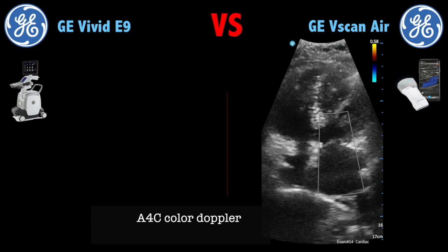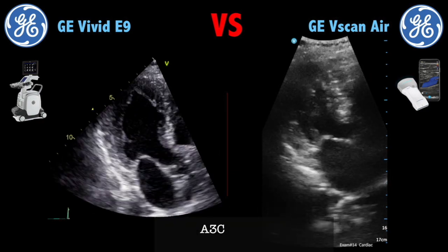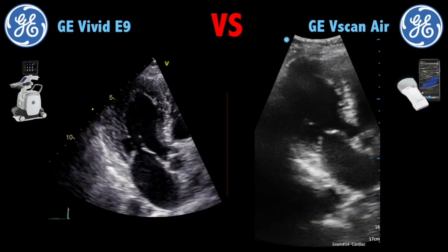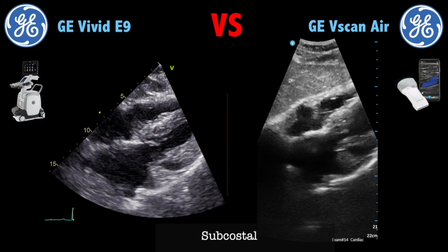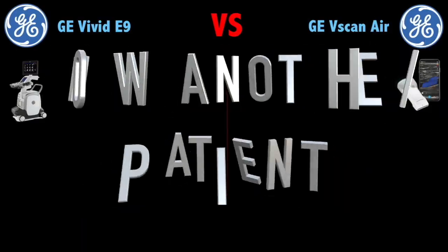This is a color Doppler. And this is an apical three chamber. This is a sub-costal view, and you can see that both images are pretty similar. For a pocket-sized device, really good images.